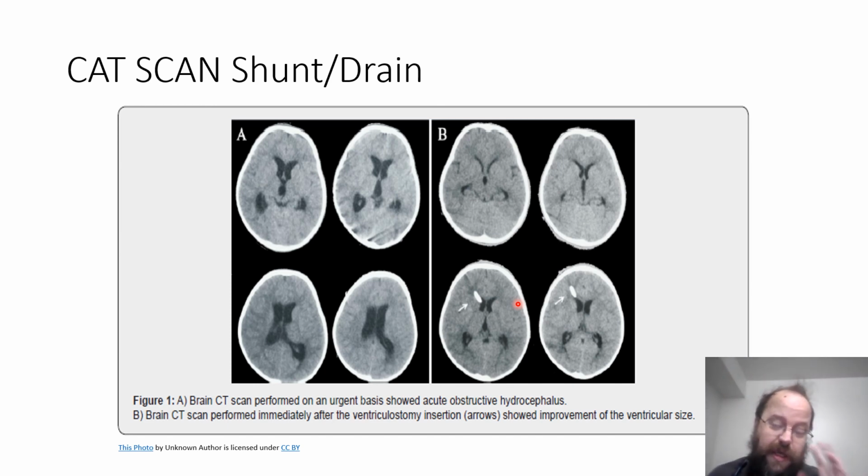And so we're going to have to turn to the MRI, which is probably one of the most useful tools that we have, because the CT imager is great for bone and looking for swelling, bleeding, those kinds of things. But truth be told, it's the MRI that makes the best images anatomically and can look at the differences between diseases and disorders and can see what really is affecting your health.